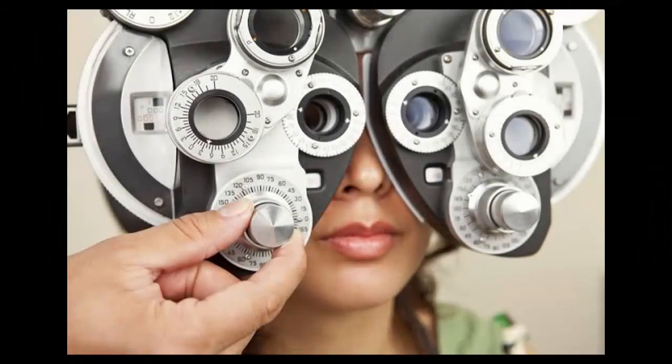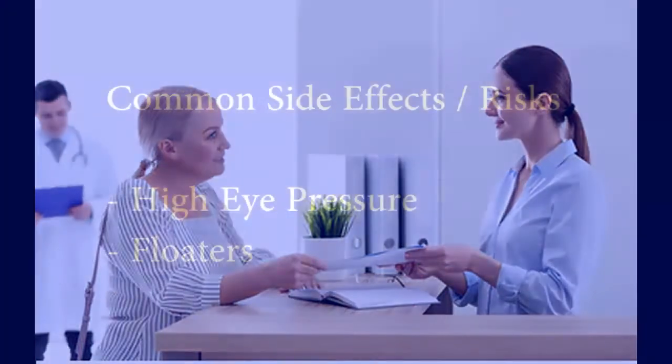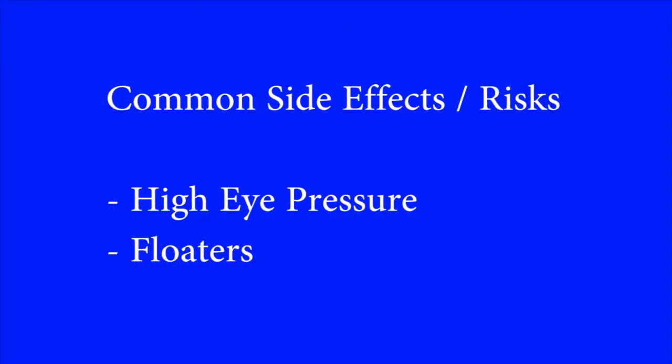The procedure usually does not change your glasses prescription much, but it may pay to visit your glasses doctor in the near future to make sure you have the best possible prescription. Although the procedure is very quick, you'll be in the building several hours since it takes time to check in, fill out the paperwork, get dilated, and check out. To be more efficient for everyone involved, we will usually group you with other patients who are having the same procedure.